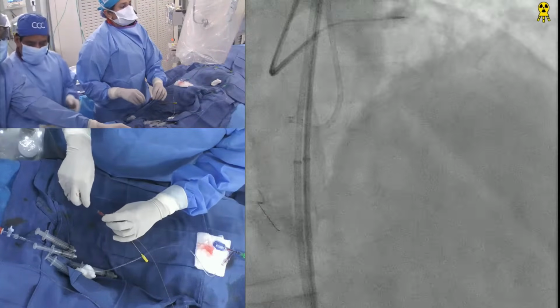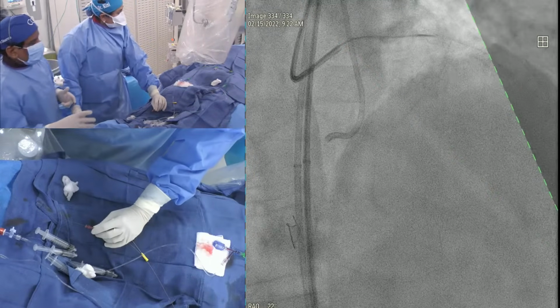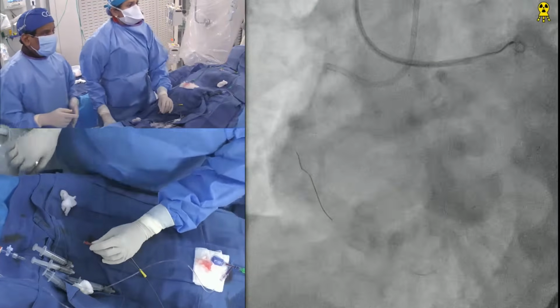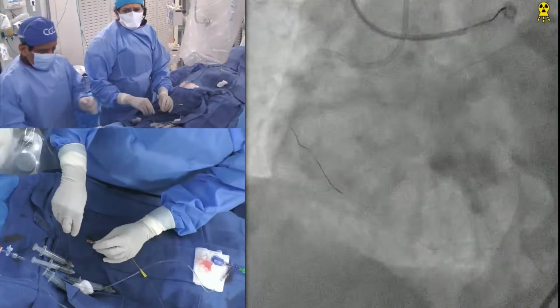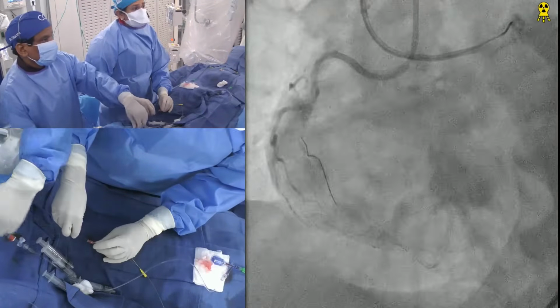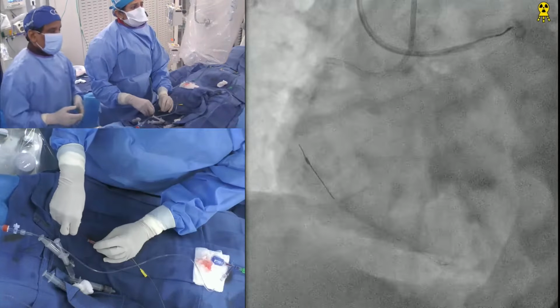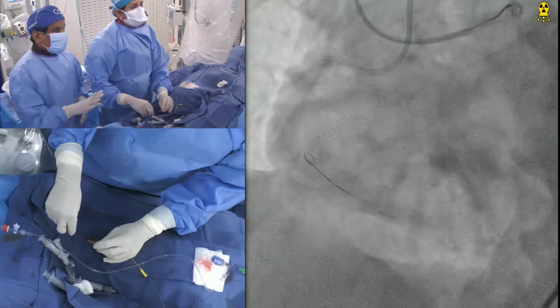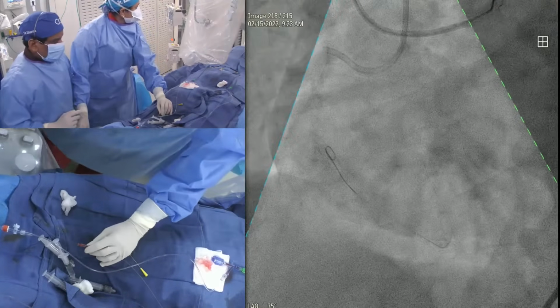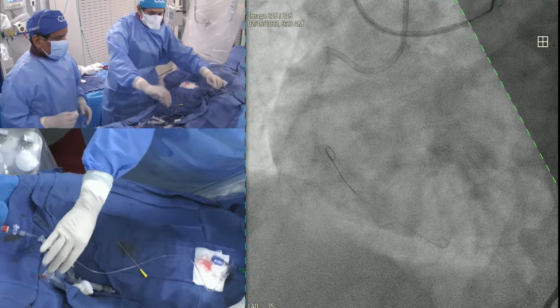Okay, come back. Stabilize this. So let's exchange it, take that out. Is the Turnpike larger, longer? 150. No, this is 150. The wire went back. Okay, just keep it there. You need a little support.